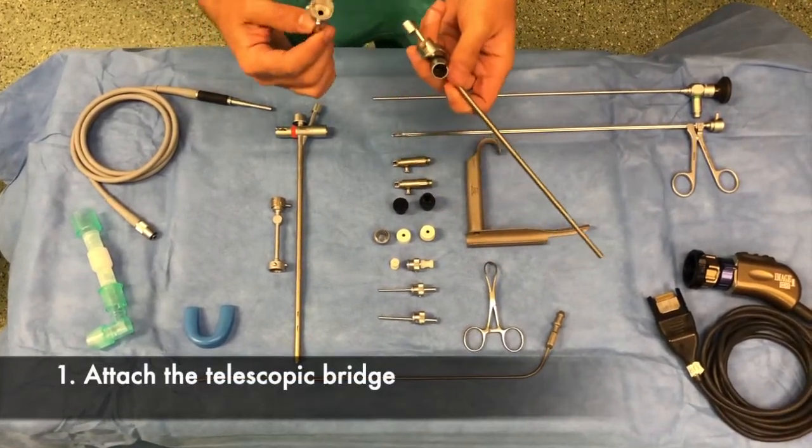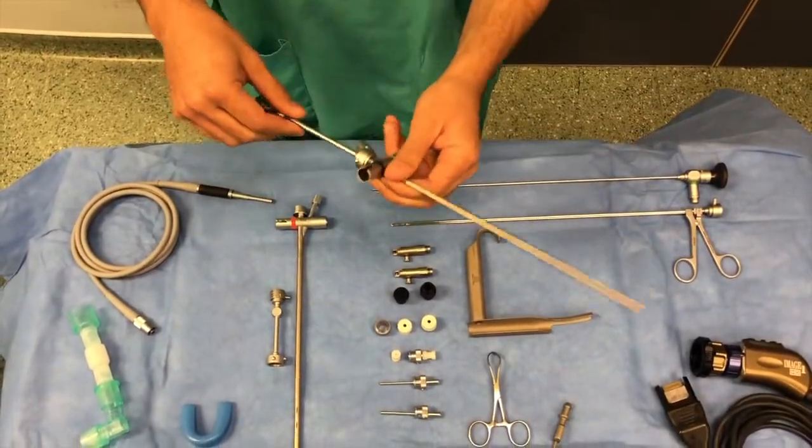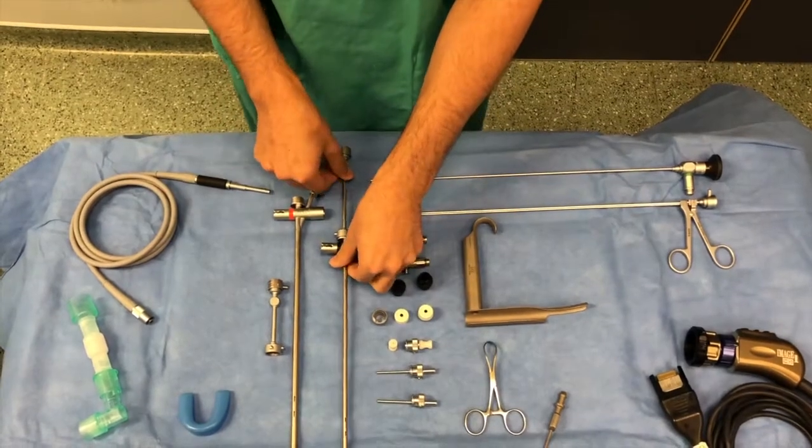The first step in assembling the bronchoscope is to attach the telescopic bridge. It is aligned and pushed and clicked into place. The bridge should not move.